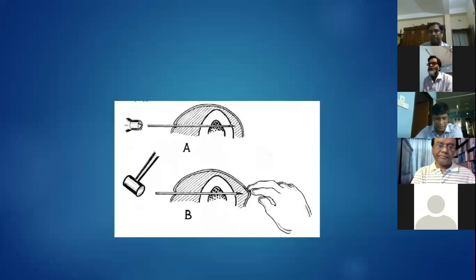At this time, when the wire tip approaches the surface, the skin at the exit site must be manipulated in the same direction as at the entrance site. Wire insertion is continued until the amount of the wire is approximately equal on both sides. In case of olive wire, a 0.5 centimeter skin incision must be made at the portal of the olive stopper wire with number 11 blade.